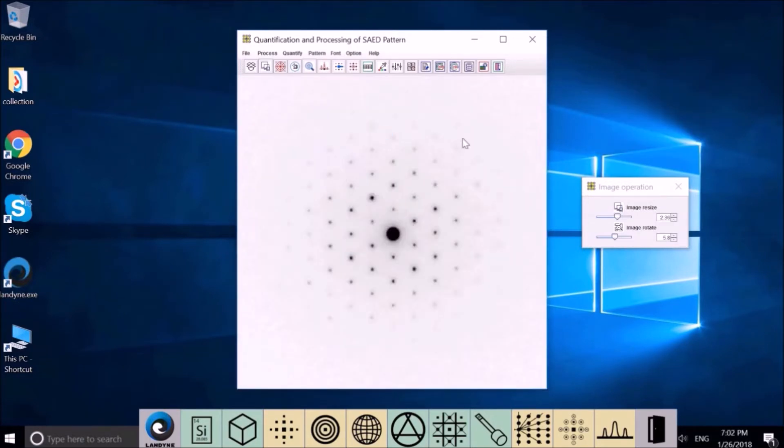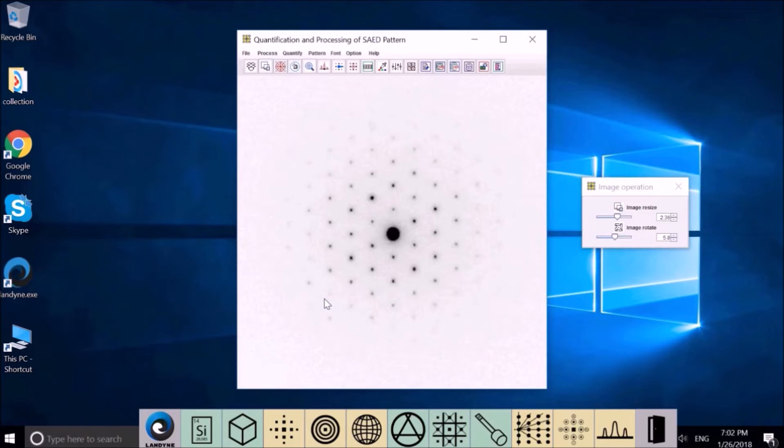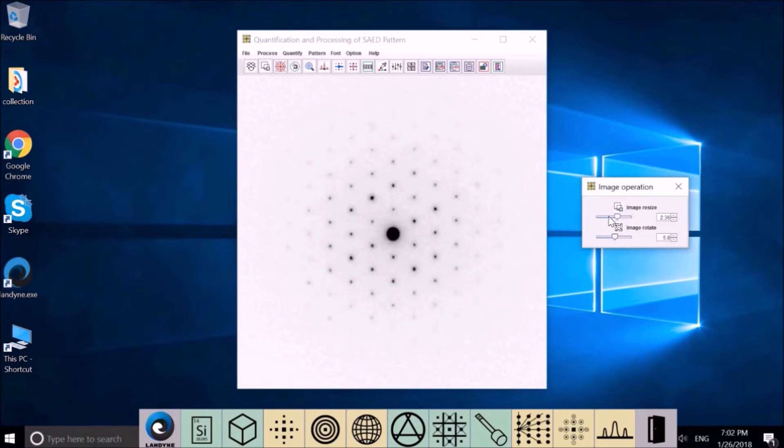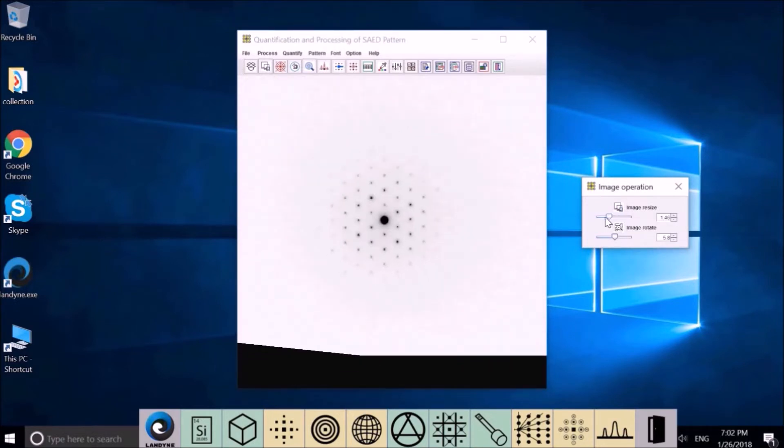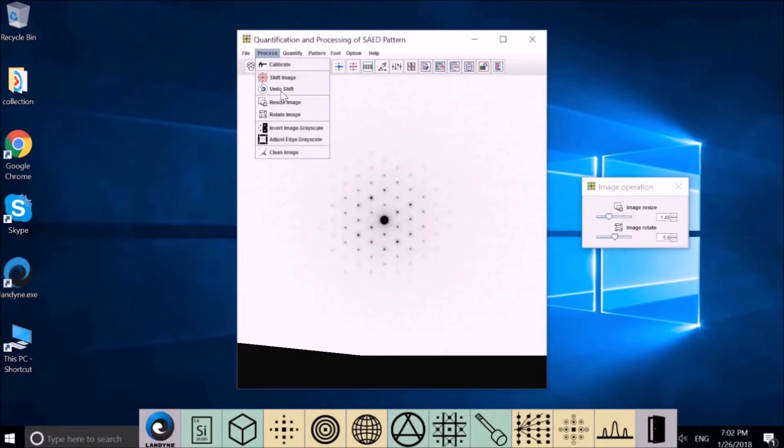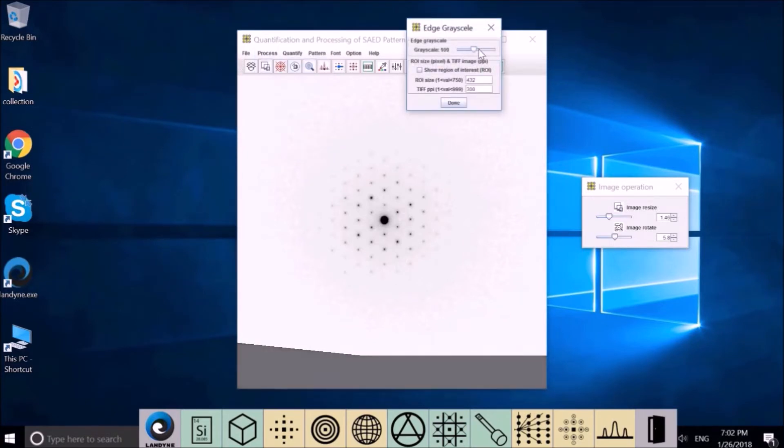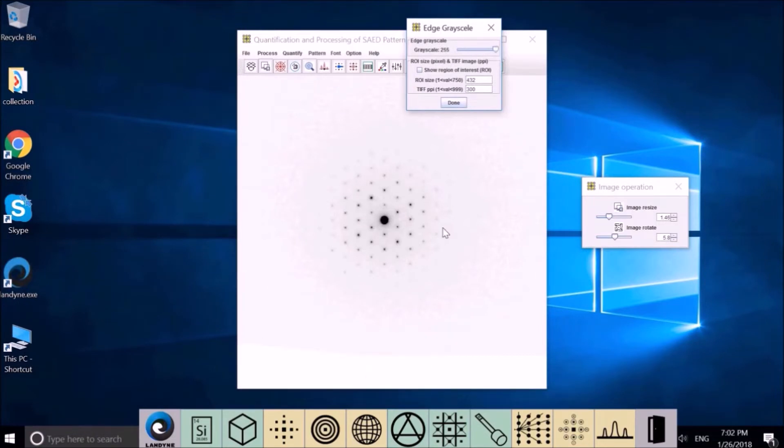So you can have the pattern contrast inverted. If the original images are small, you may have an edge leftover in other color, for example like this size. So you can adjust the edge contrast in such a case. Slide this bar too, so it may look like the same image here.